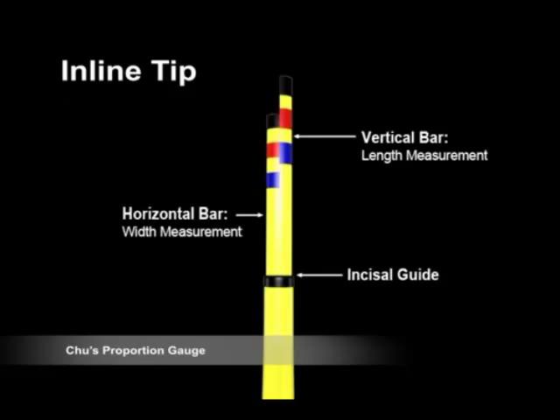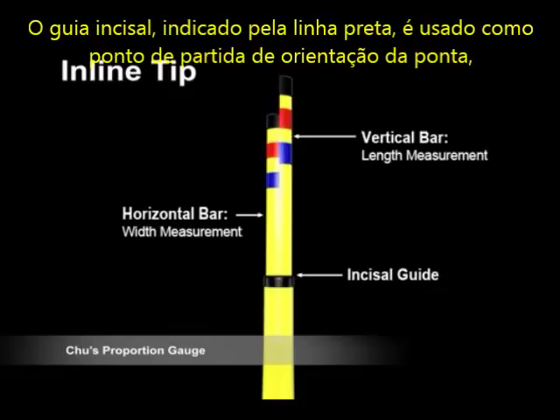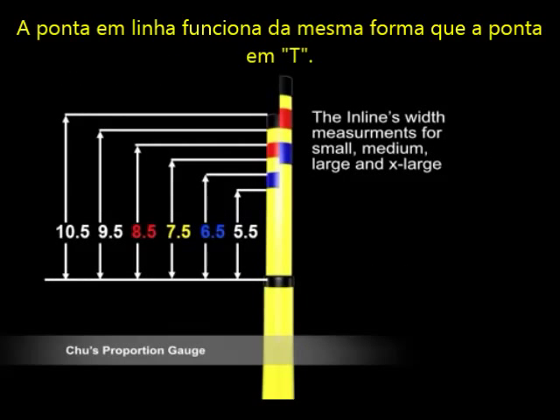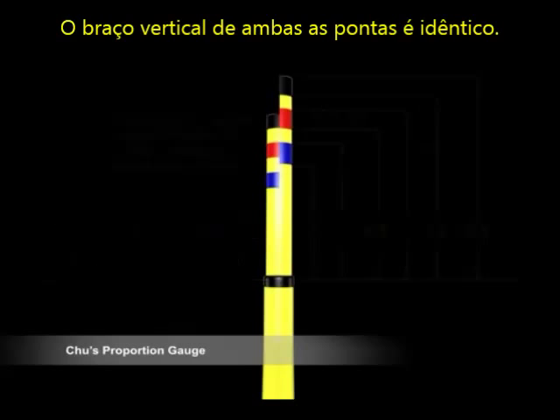Inline tip is designed to independently measure tooth width using the short arm and tooth length using the long arm. The incisal guide, denoted by the black stripe, is used as the starting point of tip orientation and measurement from the incisal edge position. The inline tip functions the same way as the T-bar tip, except that the horizontal arm of the T-bar becomes the short arm of the inline tip. The vertical arm of both tips is identical.